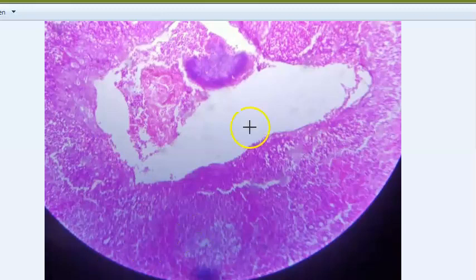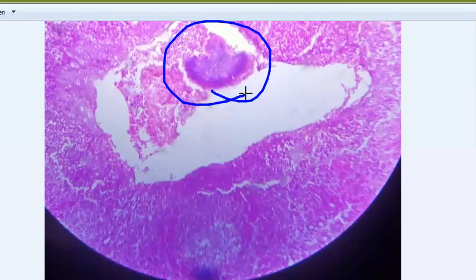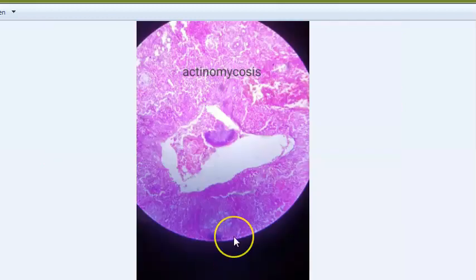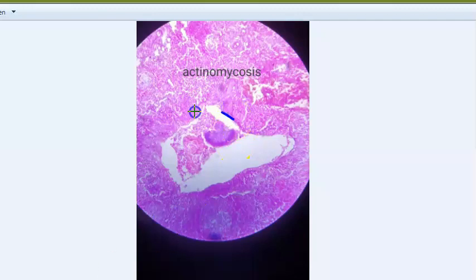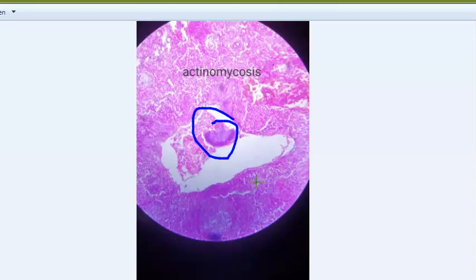The clue in the next slide is a purple body. This is actinomycosis. Here you are seeing the Splendore-Hoeppli phenomenon - this structure is the Splendore-Hoeppli phenomenon. You are able to see sulfur granules which are blue, and peripheral clubs. These sulfur granules represent the Splendore-Hoeppli phenomenon in actinomycosis. Actinomycosis is a disease caused by the anaerobic bacterium Actinomyces.